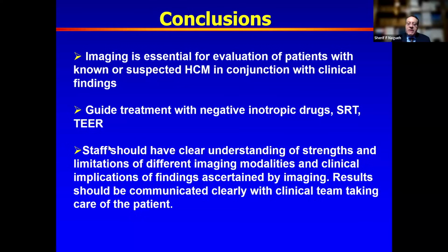Yeah, so it is possible to try to standardize this by noting how much pressure change there is with blowing in a system that allows you to see the actual pressure. I would say that may not be practical for most labs, but the sonographer should show the patient what a good effort is.